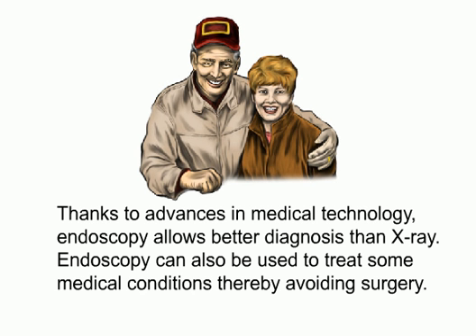Thanks to advances in medical technology, endoscopy allows better diagnosis than X-ray. Endoscopy can also be used to treat some medical conditions, thereby avoiding surgery.